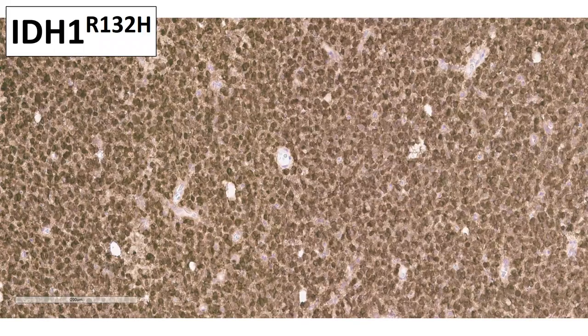All right. Molecular, here it is, IDH1 R132H, remarkable antibody. Here's the thing: the mutant protein is expressed in 100% of the glioma cells. We have a wonderful commercially available antibody, which is very robust once you have it titrated properly, et cetera. And that is a remarkable thing, basically 100% expression, extremely powerful when it's present.